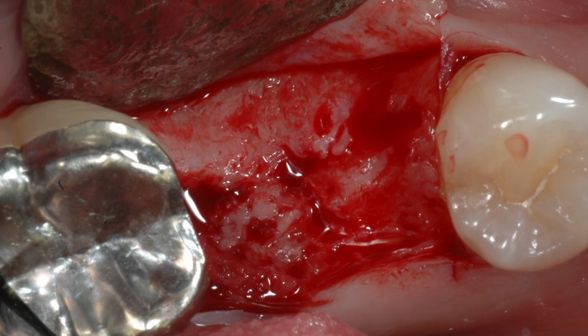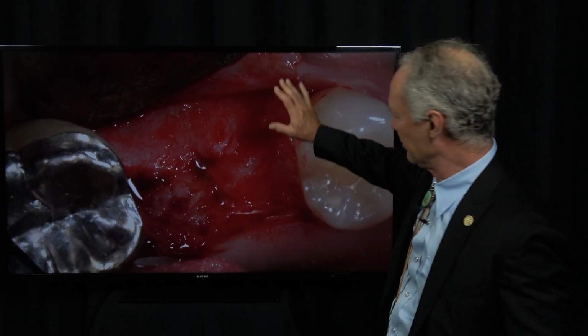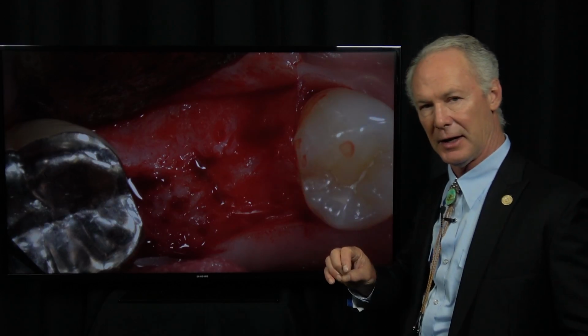Look at that. Only platelet-rich fibrin was placed in that socket, with a membrane on top of it. And look how dense that bone is after 6 months. You've got to let it heal for 6 months. 3 months is not enough. It takes bone 6 months to heal in an extraction site.